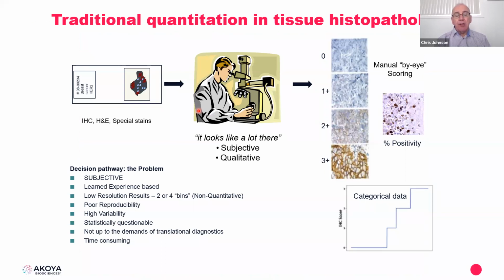An experienced user, a person who's trained in tissue pathology or tissue analysis, can look at it, and they will give some sort of evaluation, particularly if it's a pathology sample, maybe a tumor. They will give it a rating based on their observation and experience, to see what the degree of the tumor may be. This is called scoring, and it has formed a backbone of a lot of diagnostic areas in pathology in the past.